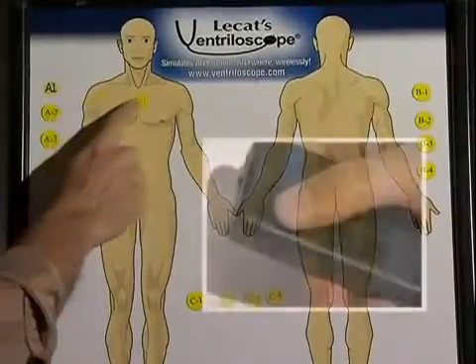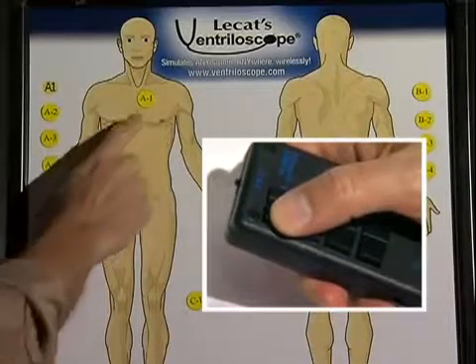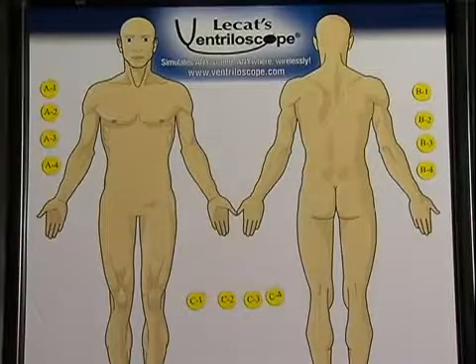The precept by numbers board can help the standardized patient understand the correlation between the stethoscope placement on the patient and which button to press to make the desired sound.